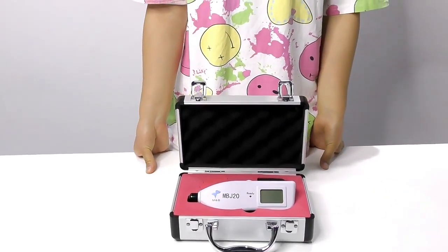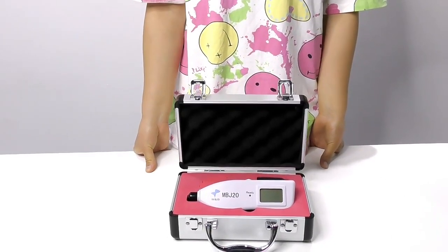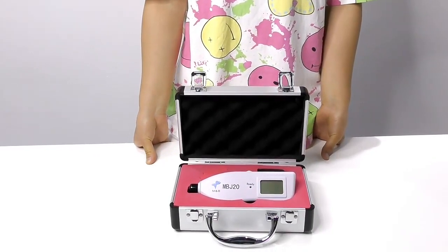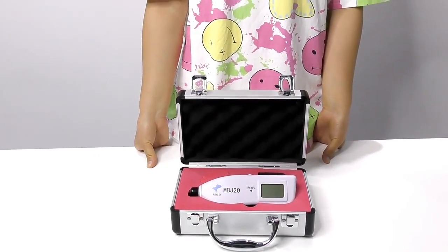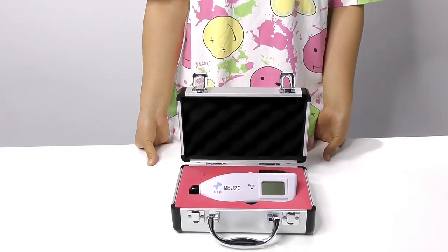The Transcutaneous Jaundice Detector MBJ20 is a portable and easy-to-use device to dynamically test clinical neonatal jaundice values. It eliminates the pain caused by blood collection for newborns and reduces the cost of a single measurement.